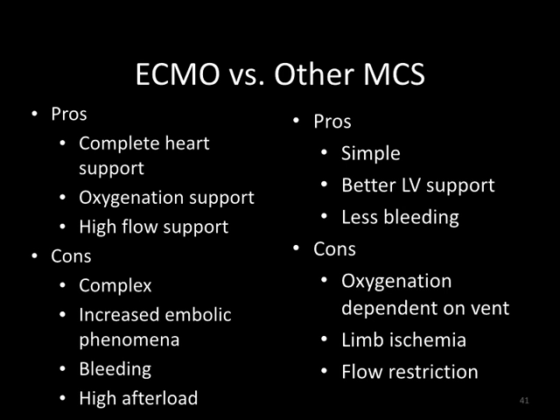The other devices that exist out there today are very simple, relatively speaking. They provide excellent LV support and drainage. You don't have to worry about LV distension and LV clot formation typically. There's typically less bleeding with them because we run at lower levels of anticoagulation, but they do not provide appropriate protection of limb ischemia.